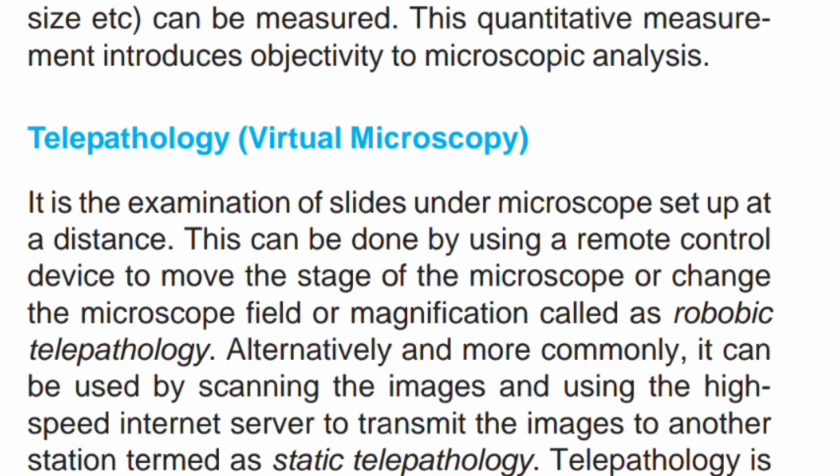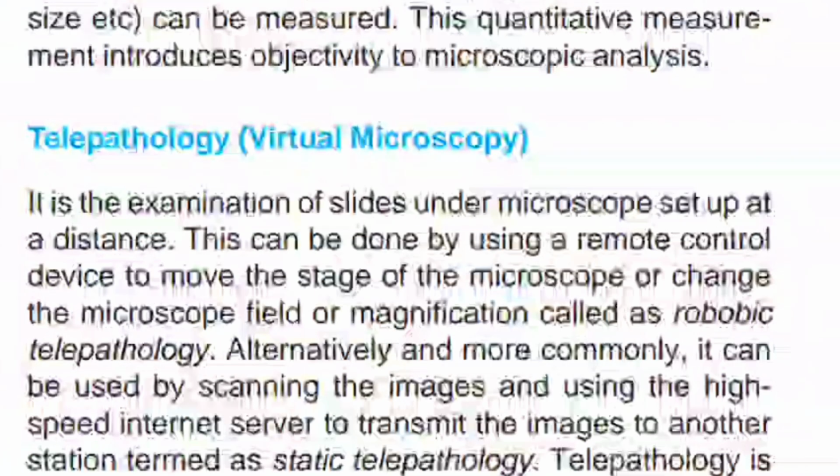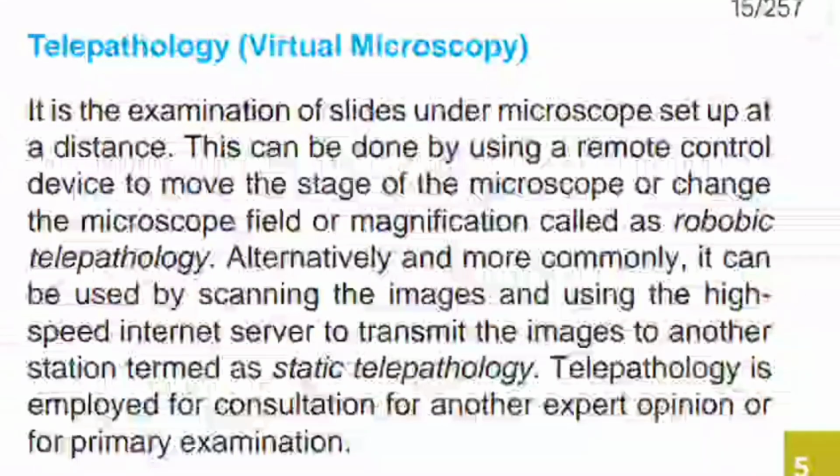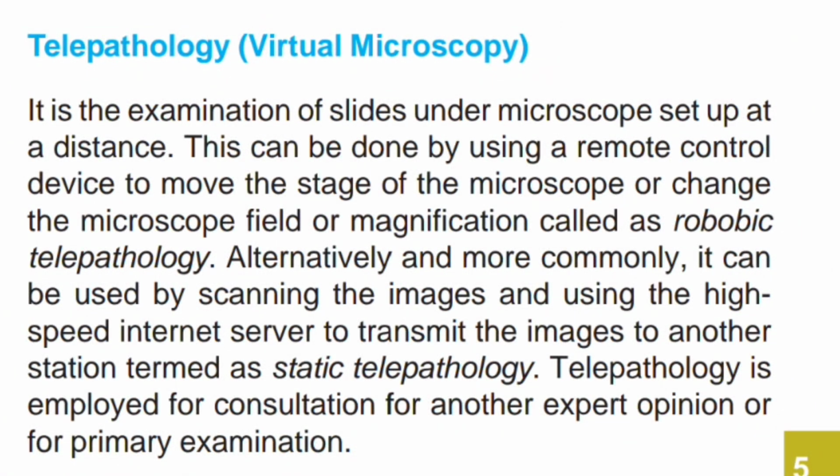Telepathology, virtual microscope. The examination of slides under microscope set up at a distance. This can be done by using a remote control device to move the stage of the microscope or change the microscope field or magnification, called as robotic telepathology. Alternatively, and more commonly, it can be done by scanning the image and using the high-speed internet server to transmit the image to another station, termed as static telepathology. Telepathology is employed for consultation for another expert opinion or for primary examination.